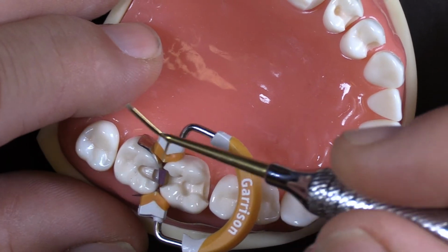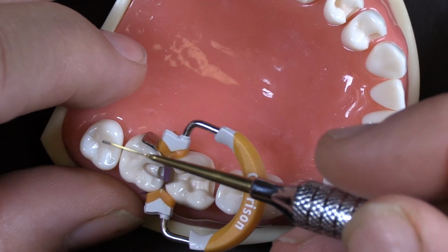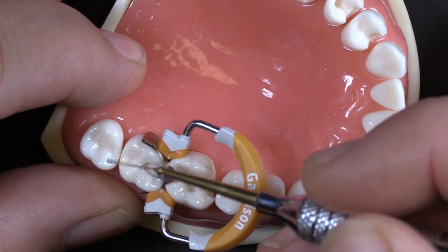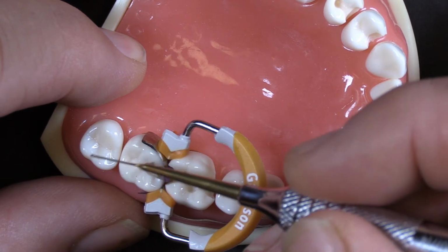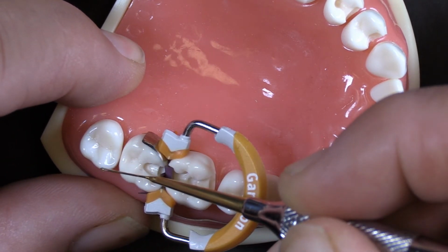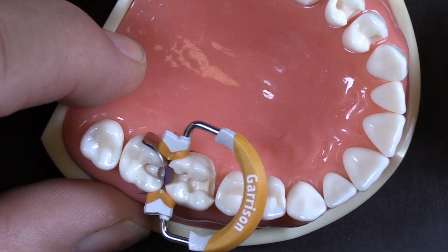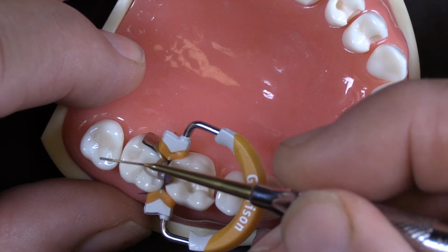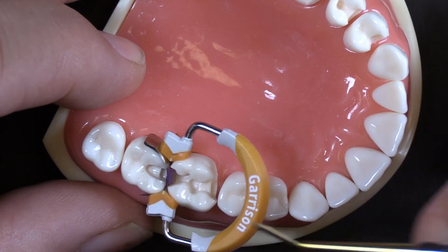Now, again, in an over-burnishing type situation, I watch people do this at the trade shows all the time when they're playing around with a matrix system on the table. They'll take an instrument and come in here and push on that band and go back and forth as aggressively as they can, and you can see it, first of all, flattening the matrix band interproximally.